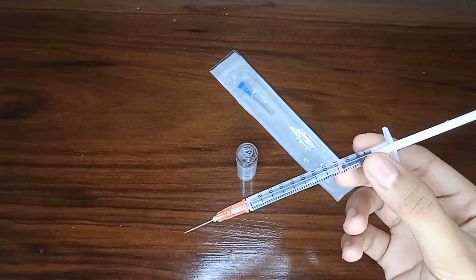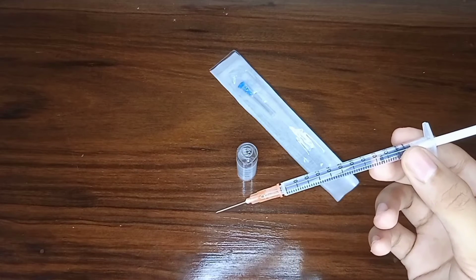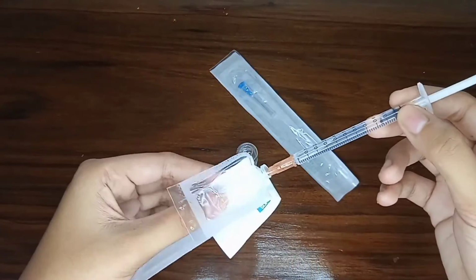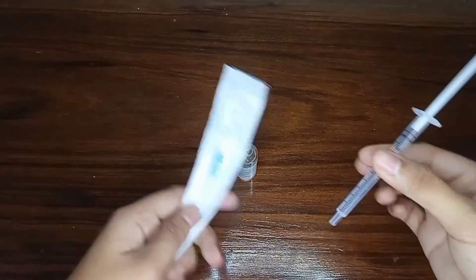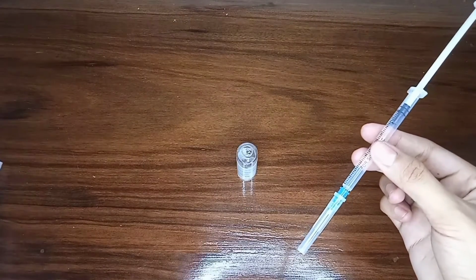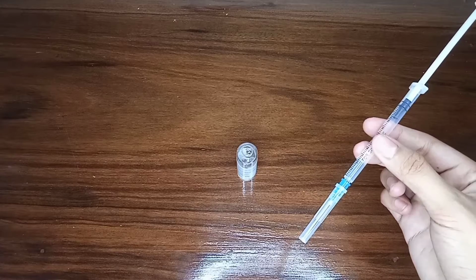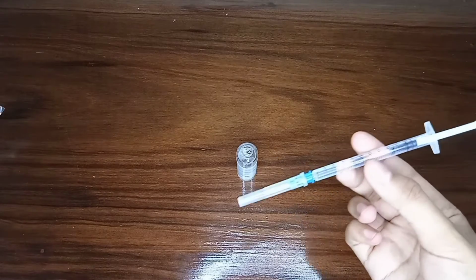Now we are going to dispose the filter needle by placing it in a sharps container and replace the filter needle. Tighten the cap of the hub of the needle and push solution into the needle to the prescribed amount. Next, we are going to introduce ourselves and verify the client's identity. After, we are now going to provide privacy for the client. It's either to close the door or to close the curtains.